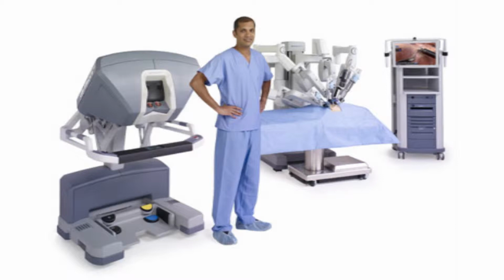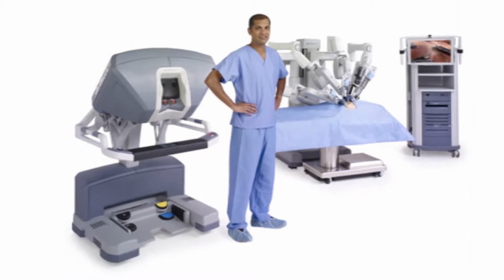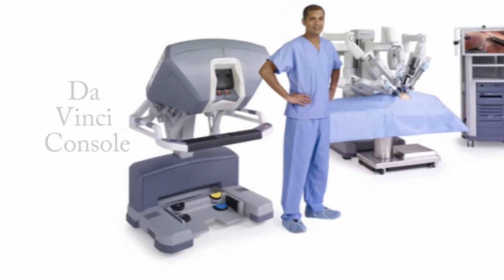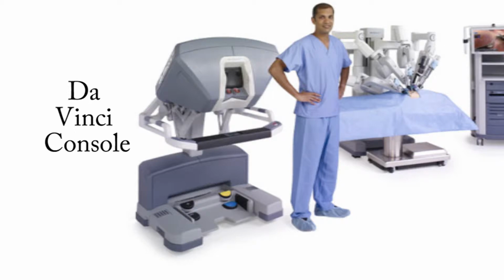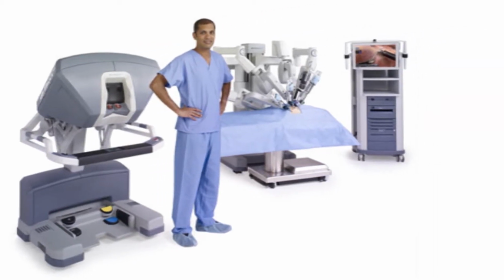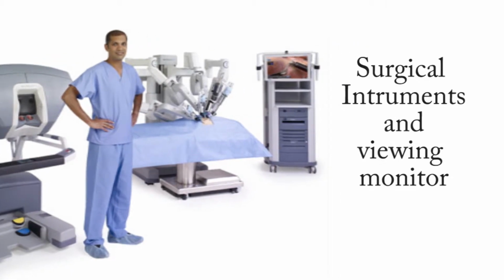The Da Vinci device. The Da Vinci is a 3D surgical endoscope device. There is a large console where the surgeon will sit during the surgery. Here, the surgeon will view a magnified, high-resolution 3D image of the surgical site inside the patient's body. The patient cart has 4 interactive robotic arms, which the surgeon controls from the console.